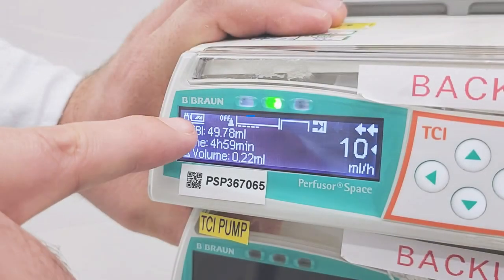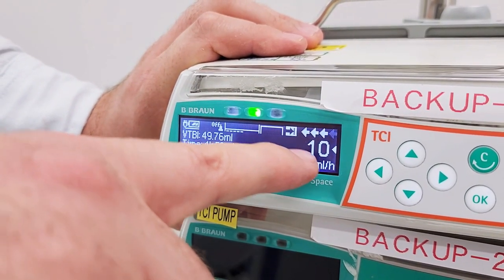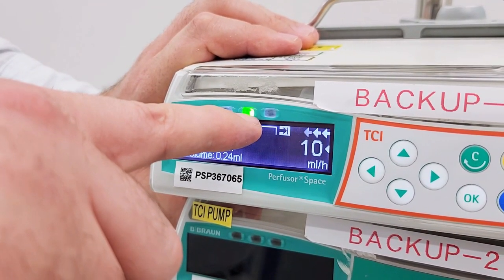We can check the battery level and the connection to electricity from this corner of the screen. These arrows and green light confirm that our infusion is running.